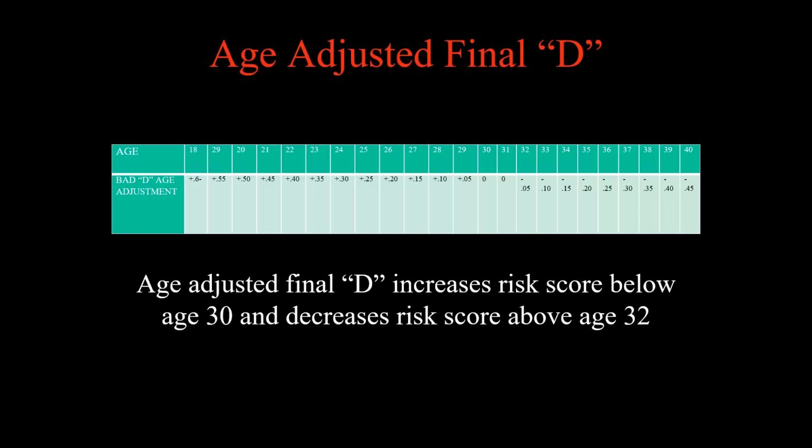And this is yet to be published, and hopefully it's going to be incorporated in the next iteration of the BAD. But basically, if your patient is less than 30 years, you add 0.05 to each year, and we stop at age 18.